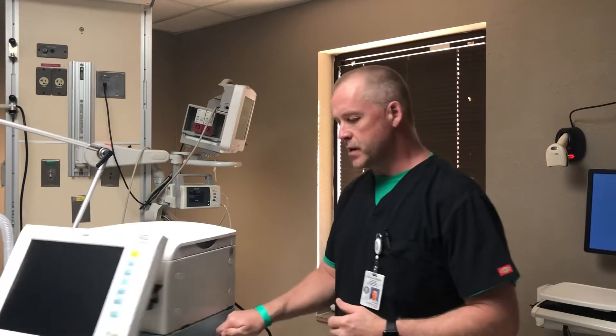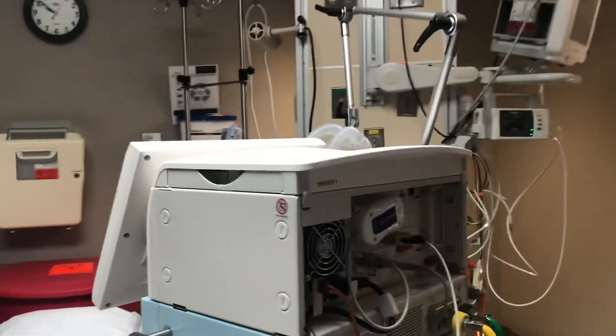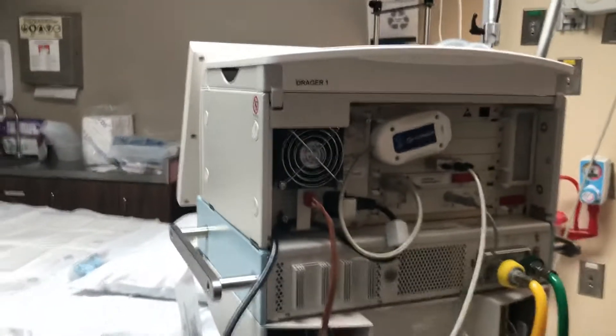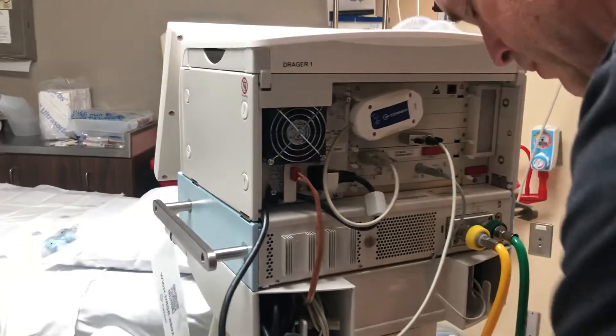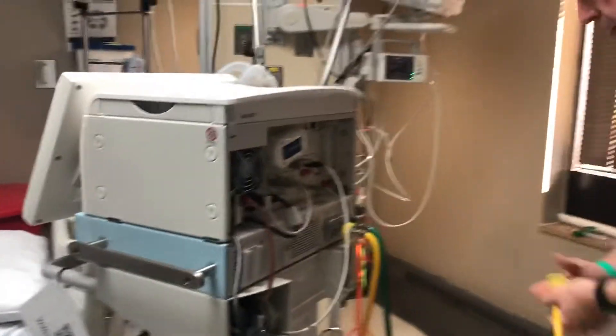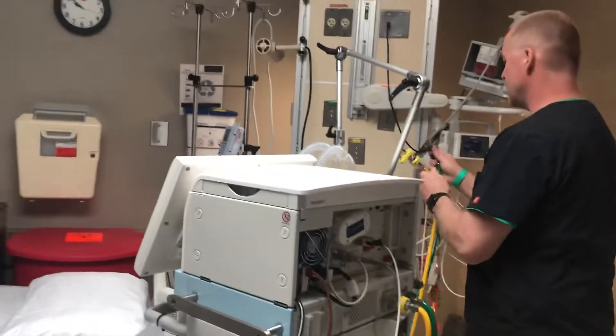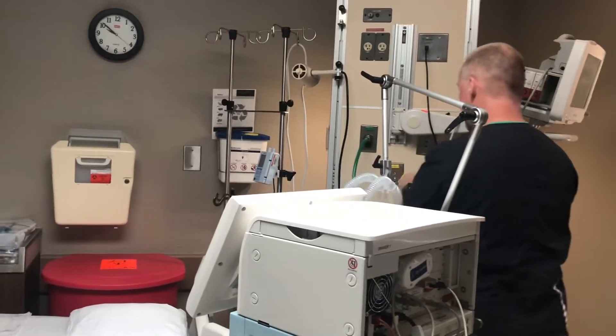Let's go and look at the back of the ventilator here. Back here we have your air and oxygen hoses. The air is yellow and the oxygen is green. We're going to take those around so we can go ahead and plug these into the wall accordingly — green to green, yellow to yellow.